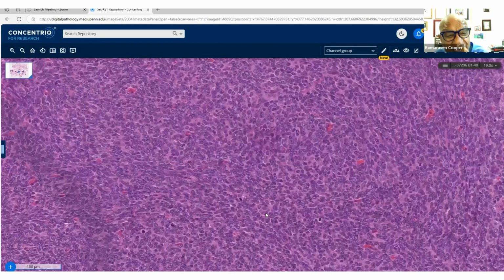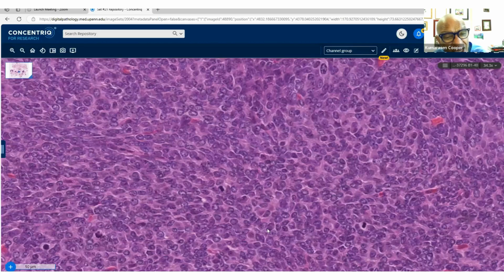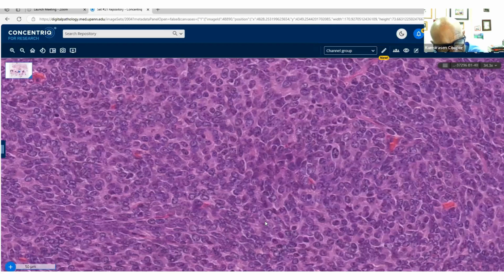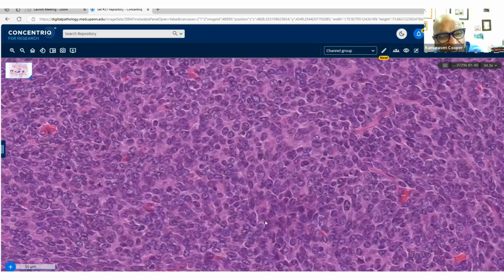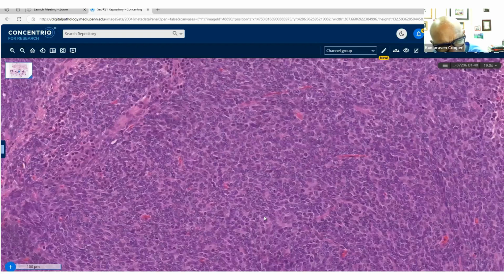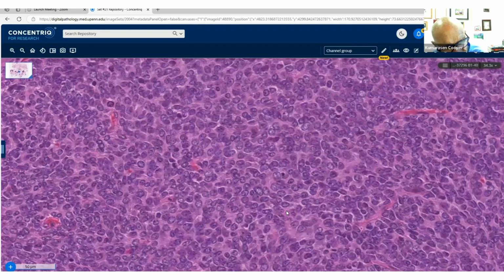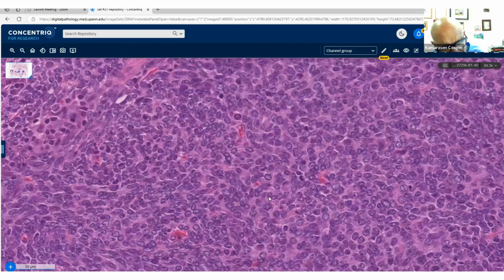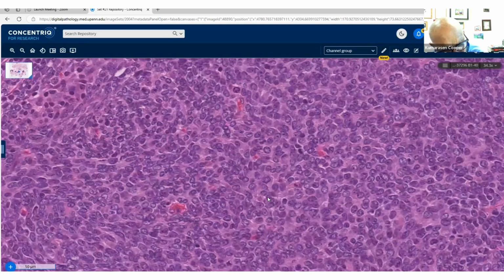So again, coming back to Carla's question, which is a very appropriate question, would you get the antibody for your panel in Botswana, say? And how often do you see synovial sarcomas? You have to work that out and decide. But there are antibodies that are available. There are two, in fact, which have been published and proven to be pretty specific and useful that you could use.